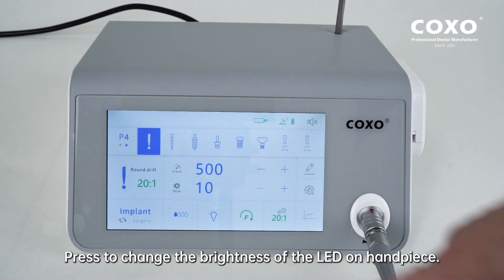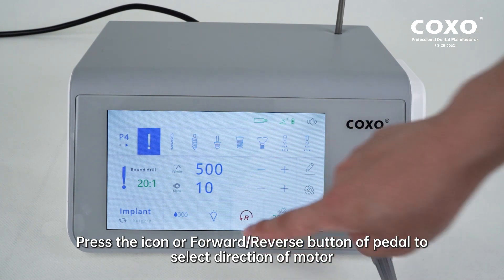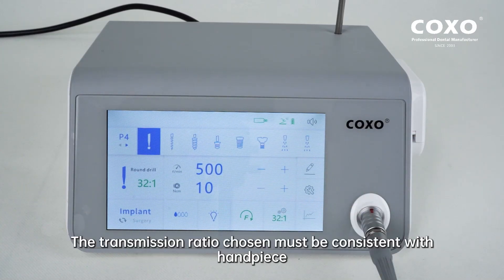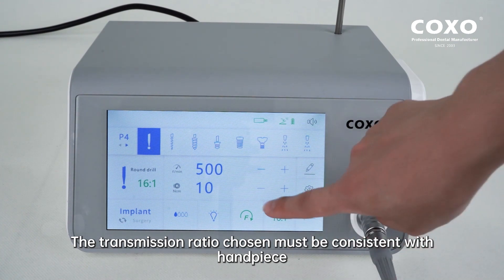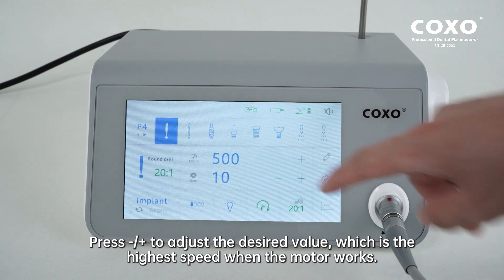Press to change the brightness of the LED on the handpiece. Press the icon or forward/reverse button of the pedal to select the direction of the motor. Press the icon to select the transmission ratio. The transmission ratio chosen must be consistent with the handpiece. Press minus/plus to adjust the desired value, which is the highest speed when the motor works.